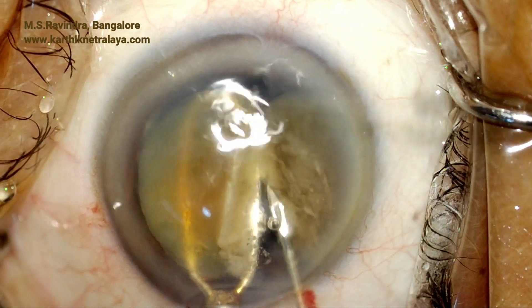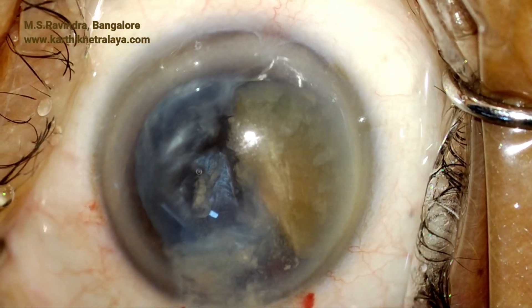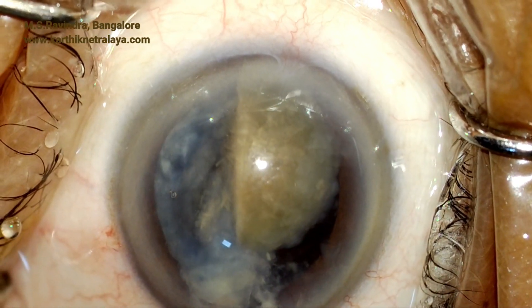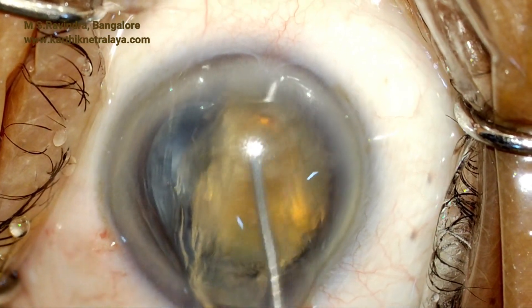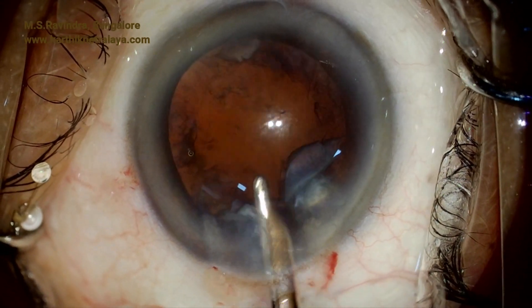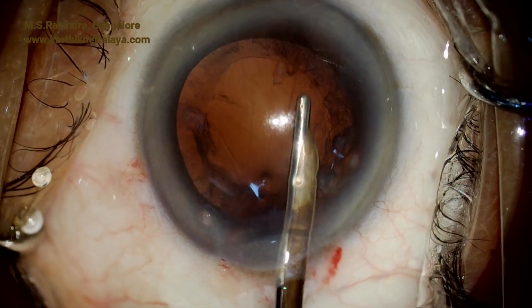The Sinskey hook is used to score the nucleus into two portions. The nucleus is now visco-sandwiched and taken out. A mini vectis is utilized to support the nucleus from behind, and it is held in front like forceps with a 25 gauge cannula which is continuously injecting HPMC, so that the nucleus is not rubbing the endothelium and reducing the specular cell count.